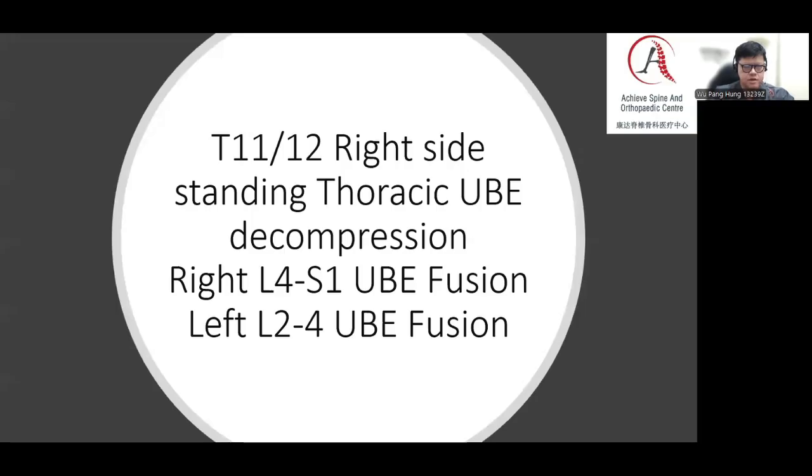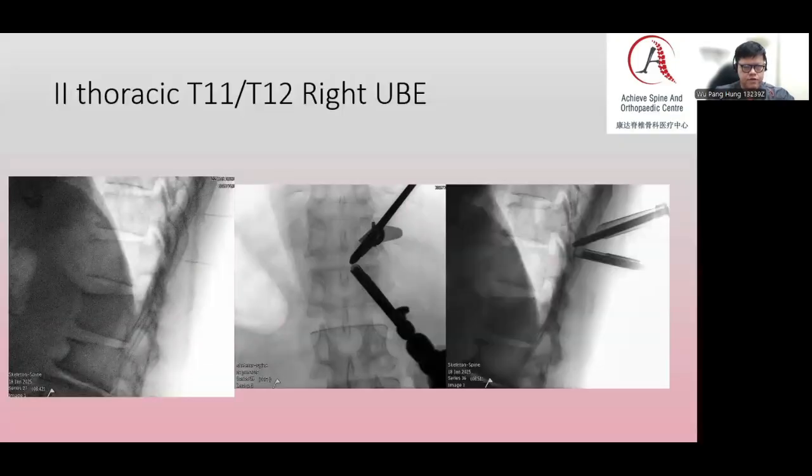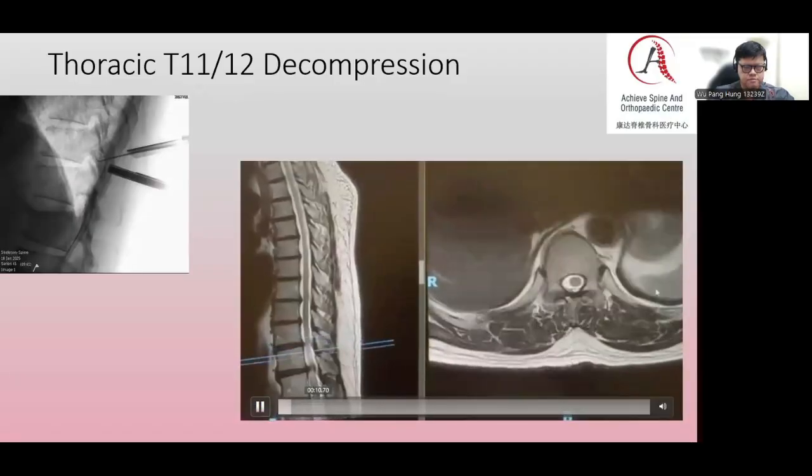So we started out with T11-12 right side approach. We decompress the thoracic spine, then stage 2 is a right L4 to S1 UBE fusion. Then we switch over to a left L2 to L4 UBE fusion. So these are the intra-op pictures. We count the level at T11-12. And then we did the spinal endoscopy to decompress the spine.